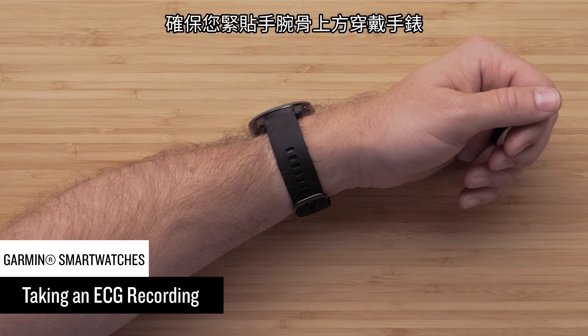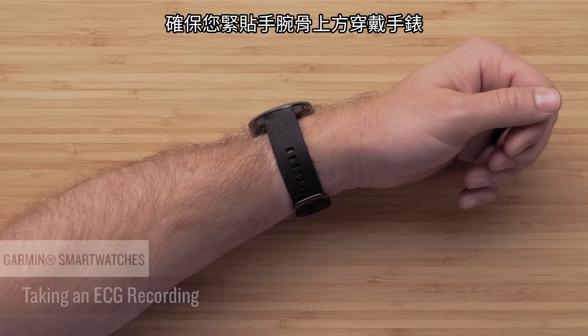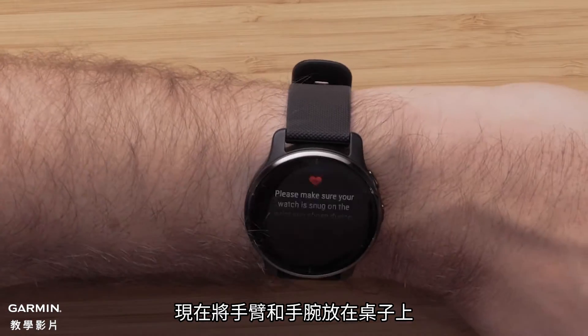Make sure you're wearing the watch snugly on your wrist, just above the wrist bone. Now rest your arm and wrist on a table.